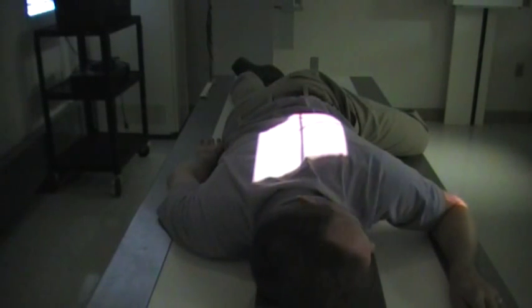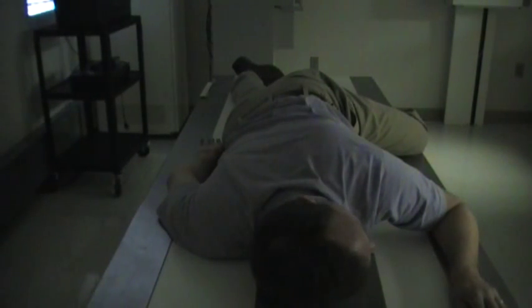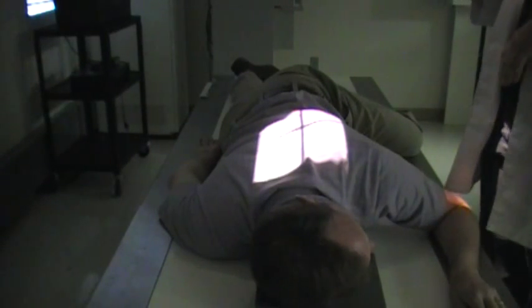On the oblique sternum, we're going to have the patient in the RAO position. Now, the body angle of obliquity is only going to be approximately 15 to 20 degrees. Now, this will, of course, depend on the thickness of the part. For a thinner patient, it may require a little bit more of a patient angle. But we are going to start at approximately a 15-degree angle in the RAO position.